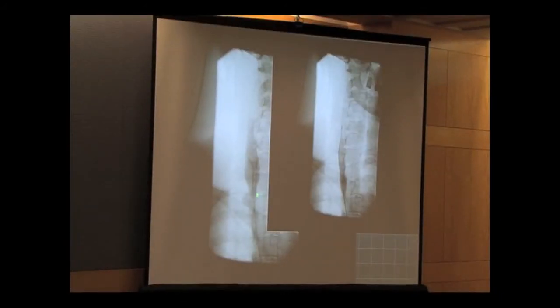Here's the angioplasty, and very typically in these cases, and I'll come back to this point again later, you see a stenosis. Here you see an impression on the balloon, and you can see it's right at the top of the clavicle here, so it's at the very bottom of the valve. In almost all of these cases, that's usually the tightest and the most difficult to eliminate stenosis. There's a second impression up here, probably in this portion of the valve. Occasionally you'll see multiple indentations, but the most consistent one is right at the very bottom of the valve.